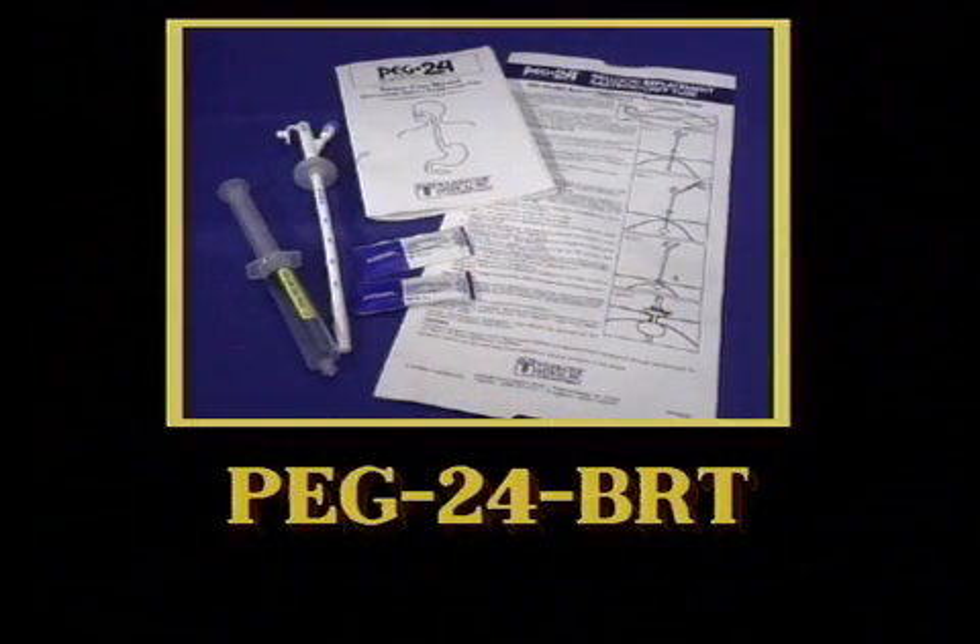This section will discuss the PEG24-BRT balloon replacement gastrostomy tube. Designed to fit an established 24 French tract, the PEG24 balloon replacement tube offers superior formula flow and improved stoma maintenance.